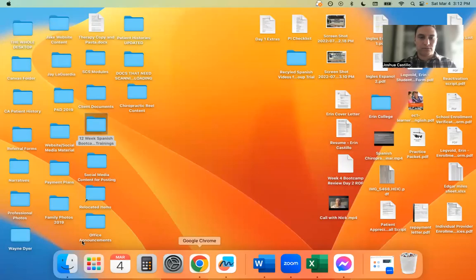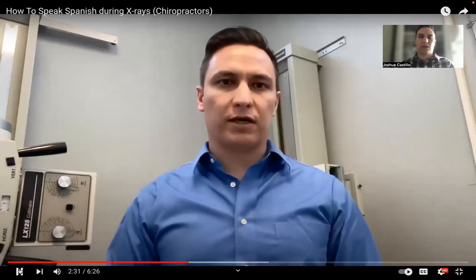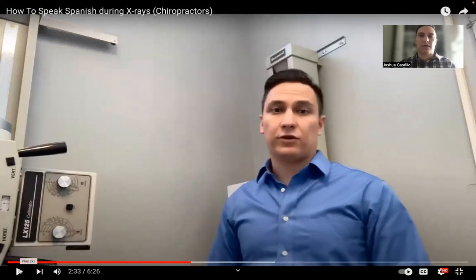Let's keep going. There we go. Great, boom, done. If, for example, they're, no te muevas. No te muevas. I forgot to do that one. Once they're in the right position, you can say no te muevas, por favor. I had a patient teach me that one time. It was awesome. I didn't say it quite right, and then he corrected me in how it made sense to him, and it's worked every time since then.